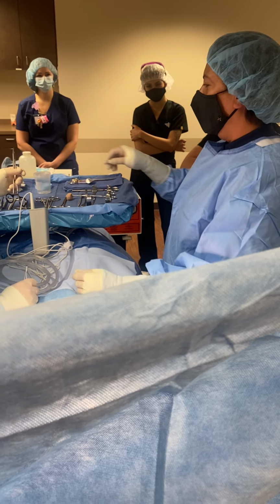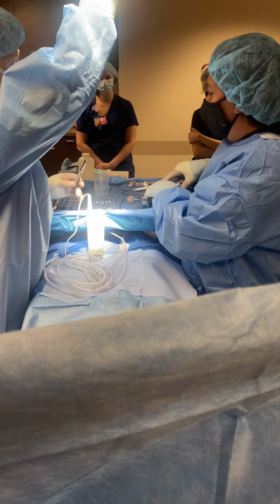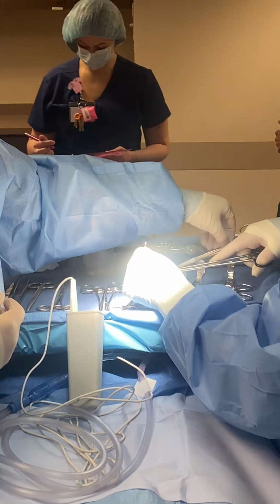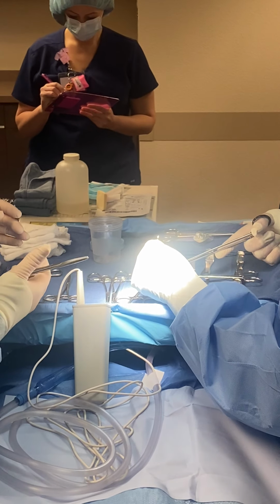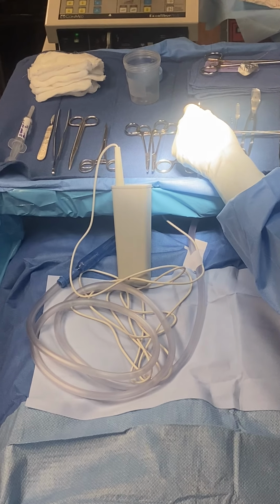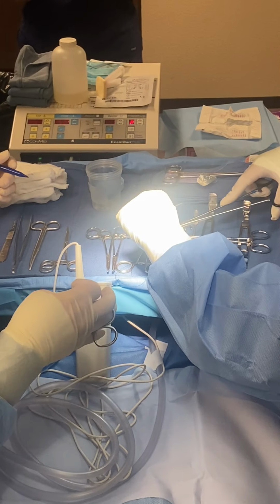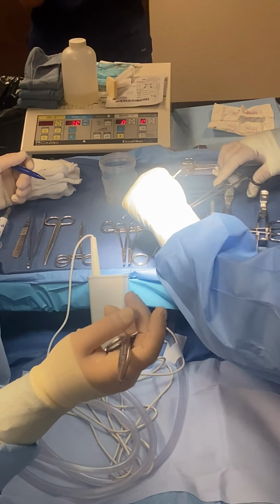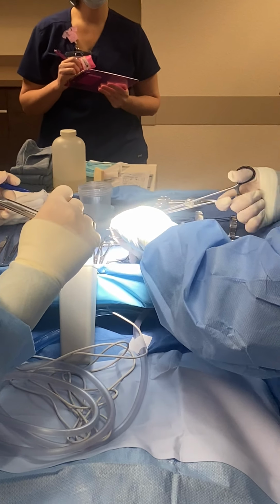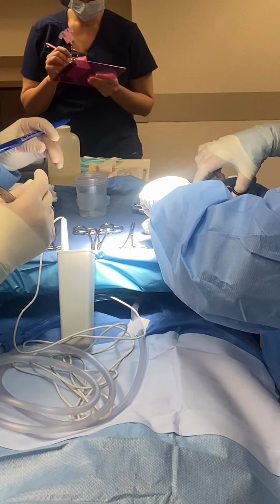Thank you. So we're going to mark. Alrighty. So the long stitch is going to be anterior. Super long stitch. Well, you know, pathology needs all the help they can get. Yeah, that's true. They always say never leave it questionable. Exactly, because they will find a question. That is the truth.